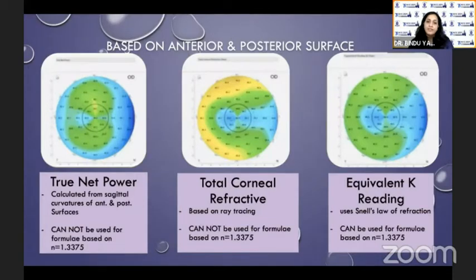After adding the two, it also does the adjustment for the change in the Gullstrand ratio which the patient has undergone. Therefore, it gives the most accurate value, which can be utilized for the newer generation formulas which use a refractive index of 1.3375, like Barrett TK.